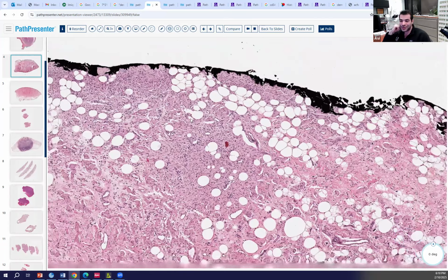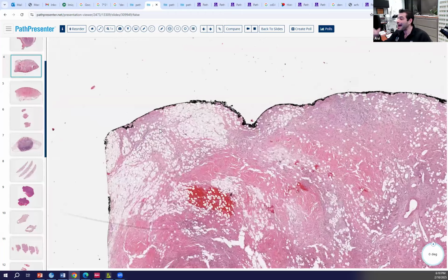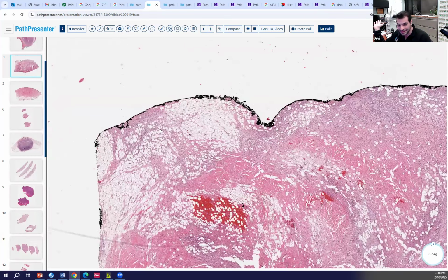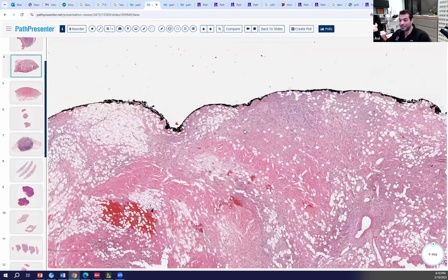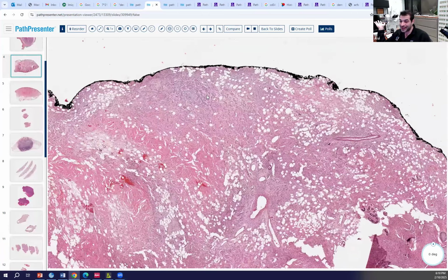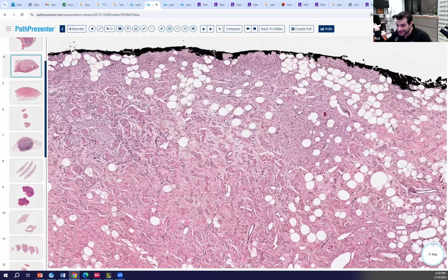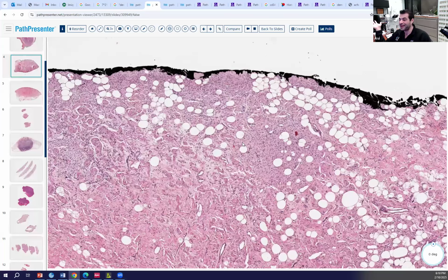That's one thing that traps some dermatology residents. They see something infiltrating into the fat. Aha, it must be DFSP. Any spindle cell thing that grows into the fat has to be DFSP. No, diffuse neurofibroma can do that. And something else can look like it's doing that, but really it's part of the tumor. Spindle cell lipomas can look like that, but instead of infiltrating, the fat's part of it.